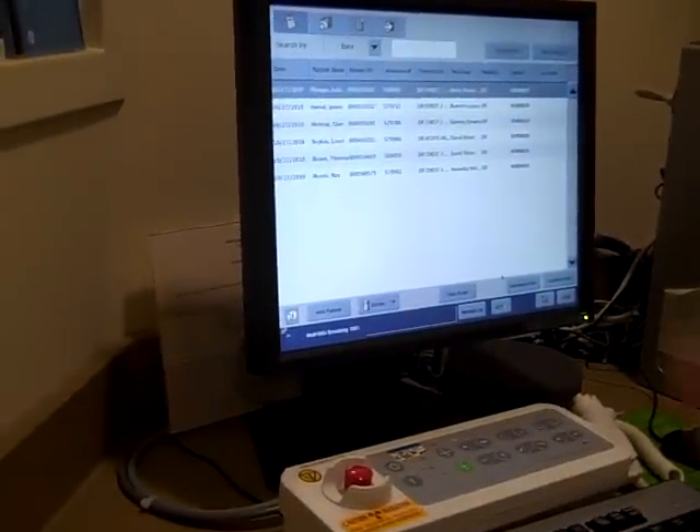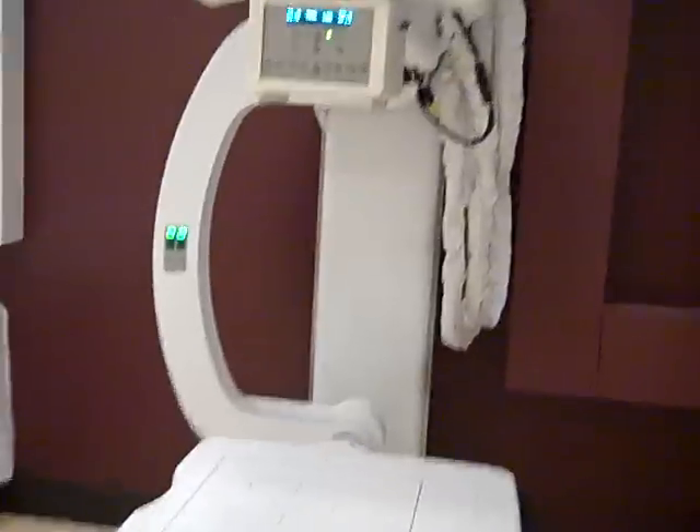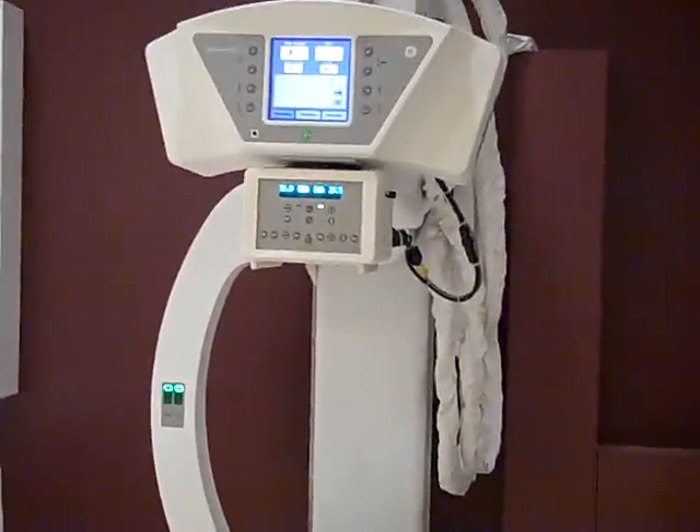This is where the pictures pop up. All the pictures show up on the screen within seconds of us taking them.